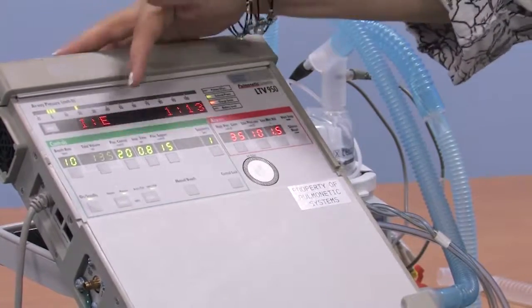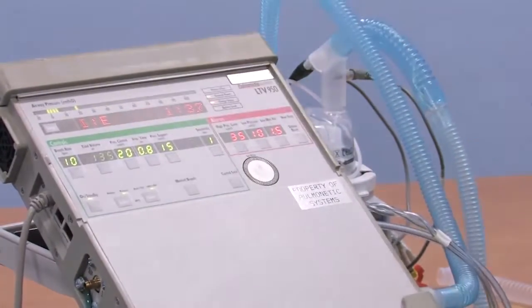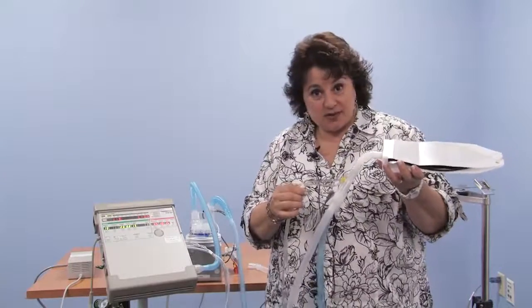In addition to that, the breath rate, awake and asleep, the amount of air they receive when they're awake and asleep, all of those things are tools you can use to help you evaluate your child. The last parameter under the select window of information that the machine receives from these transducers is the ratio of time in to time out. We want to make sure that your children have enough time to blow out before the next breath comes in, and that looks at that ratio. There is no alarm for that.